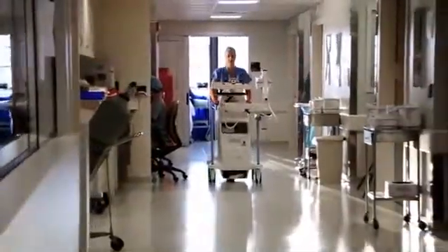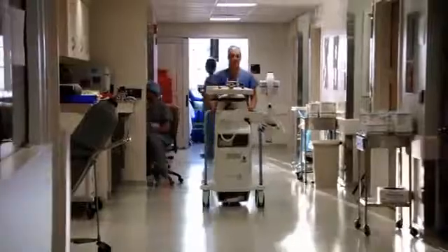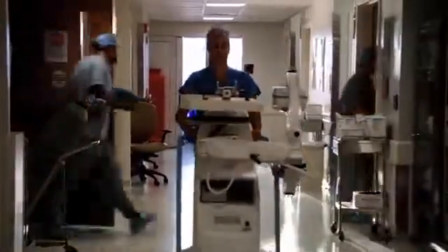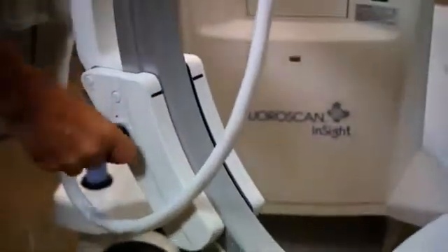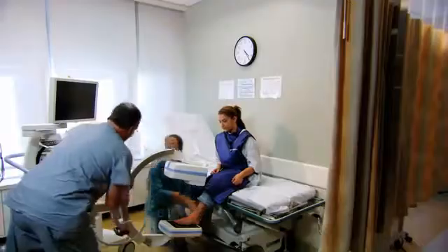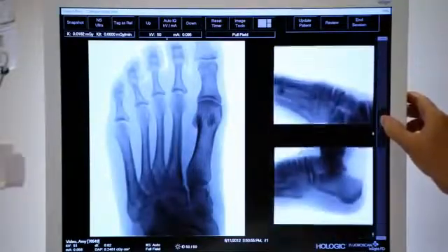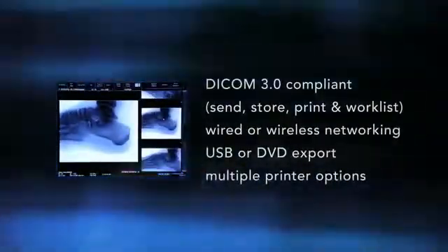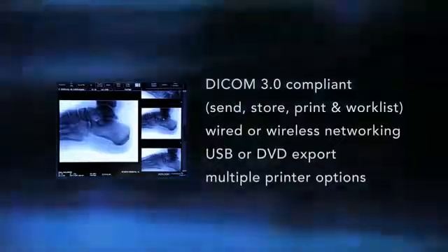In between procedures or exams, Fluoroscan Insight FD easily folds into a portable cart with a small footprint. It's easy to maneuver, making it ideal for any facility where space and time are a premium. And like every Hologic imaging device, it offers the full range of today's connectivity options, making it easy to manage, store, and share information with the facility's PACS or EMR systems.